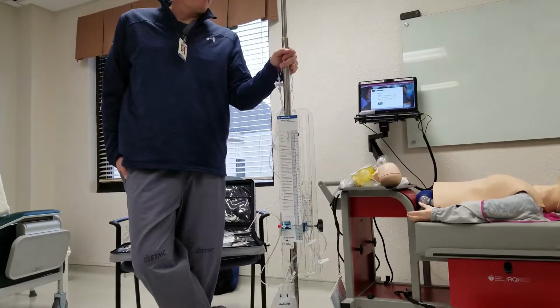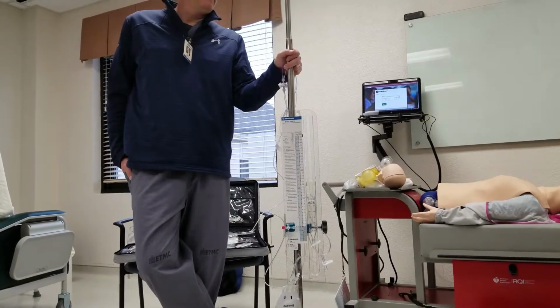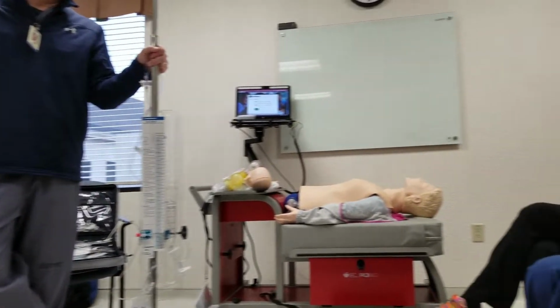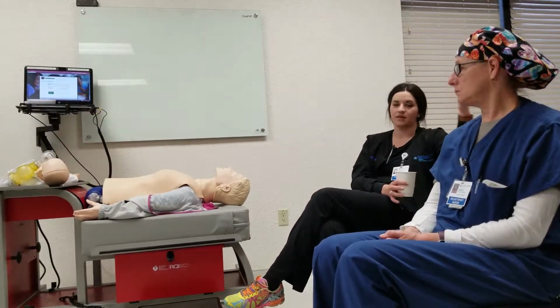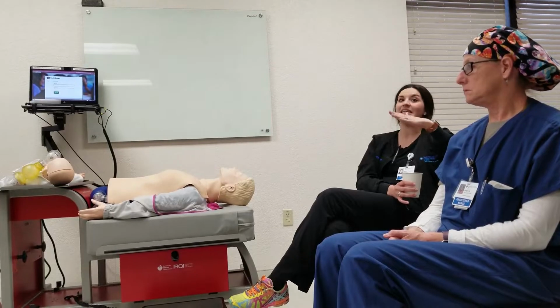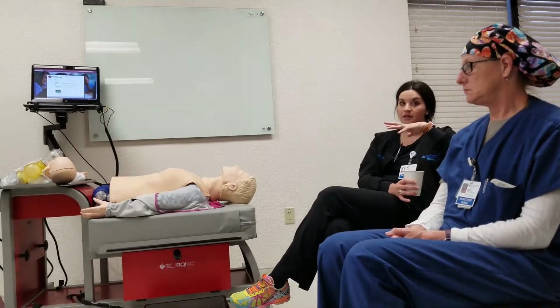Your intervention is set for every hour simply for that reason, that this is such a high acuity, low volume intervention for such a sub-select group of patients. The last thing we want is for you to look at the drain in the morning and then 6 hours later go in and look at it. So at least every hour you should be laying eyes on that drain.